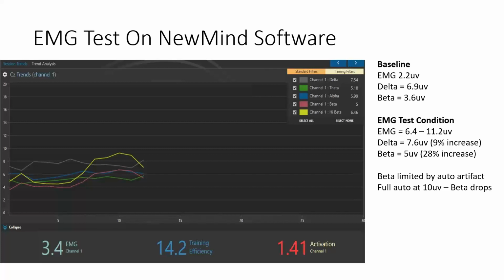We're blocking out the high-end EMG, because that's what really interferes with your neurofeedback and with valid mapping info. So when I kept it in that range, you can see I was able to get it up to 810. Now up here, I'm probably at 50%. Down here, I'm probably more like 30%. So you can see on our software how that reacts.